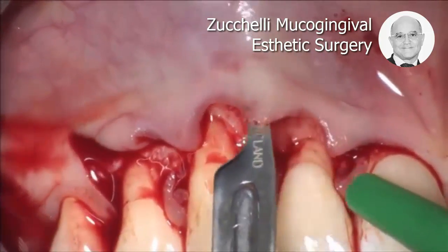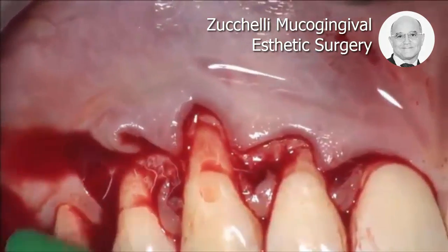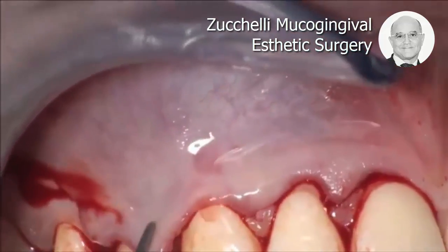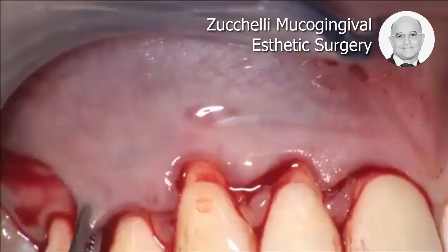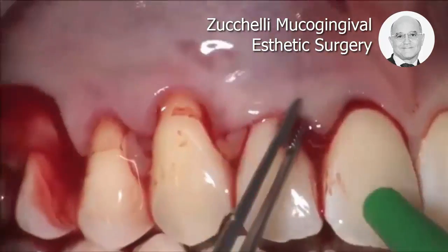There shouldn't be any interruption in the movement of my blade below the tissue. And this is more than enough to coronally advance the flap at the level of the canine and at the level of the premolar.